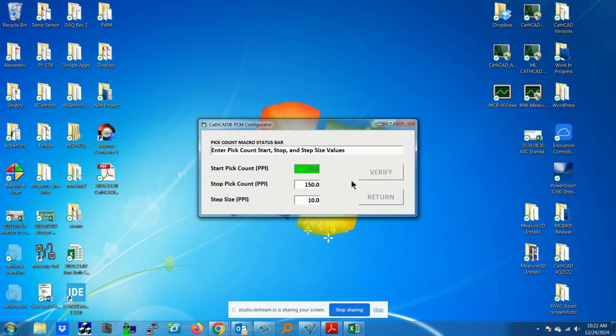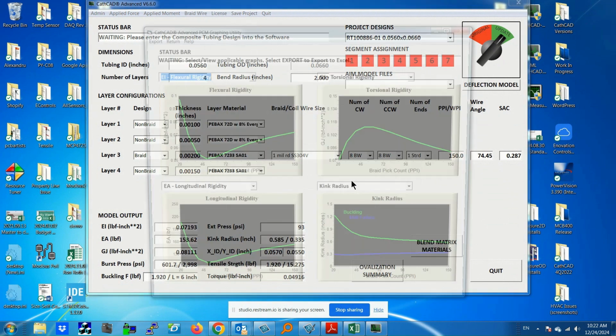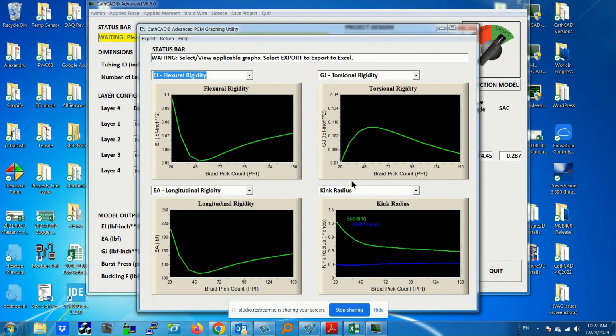And I'm going to hit the start button. Software is going to make sure all the values are good. It says we're going to do 14 runs. And now here we go. And so now you can see how quickly this is being done. And you might want to say, well, where's all this data going? Well, number one, it's going into our Excel spreadsheet. But at the same time, we're making some graphical representations that the user of the software can look at. There are 8 parameters. We're going to show basically 4.